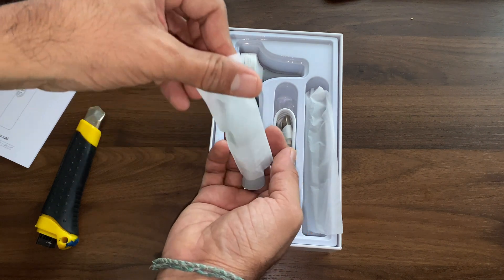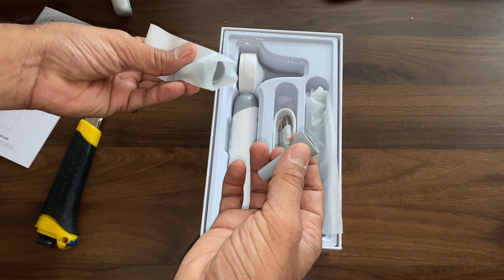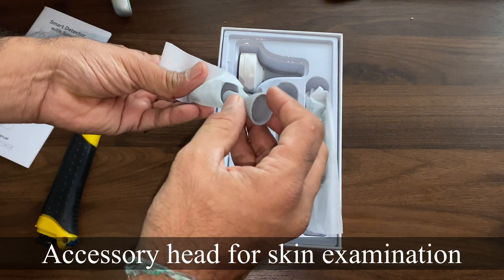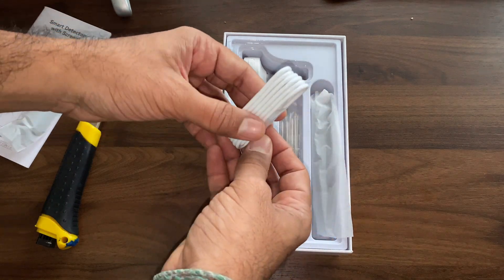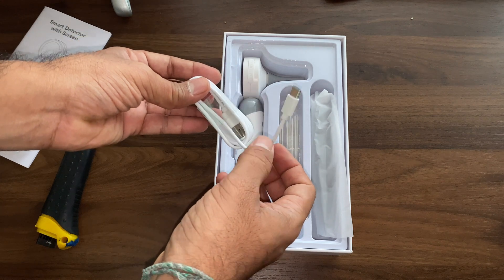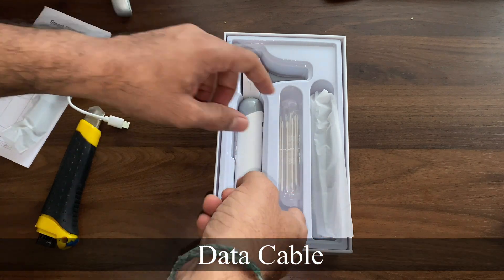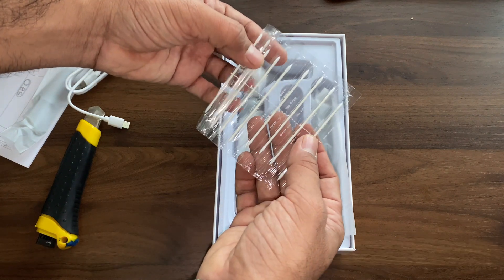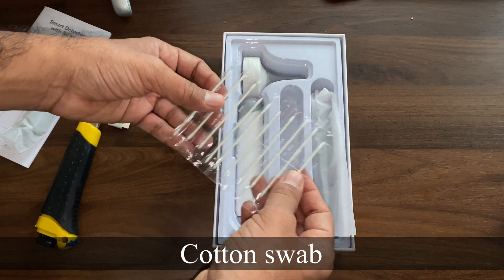With this instrument we get 2 types of accessory heads. One accessory head is for skin lesion examination. The instrument has a metal sleeve over which we can put the accessory heads. A USB-C type cable is included for charging the instrument or connecting it to a computer.